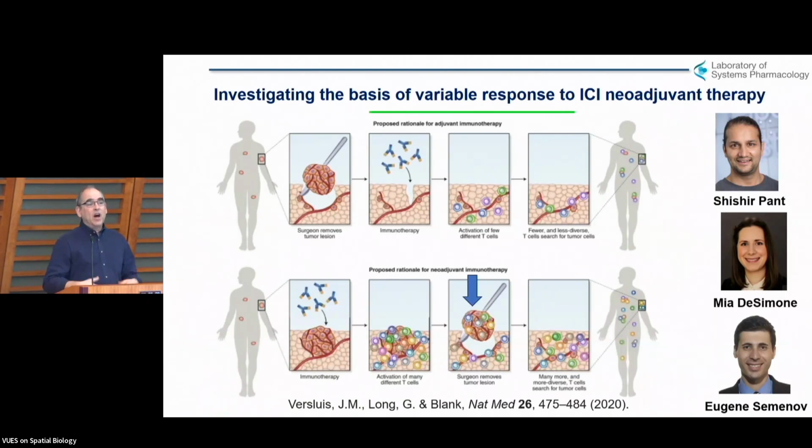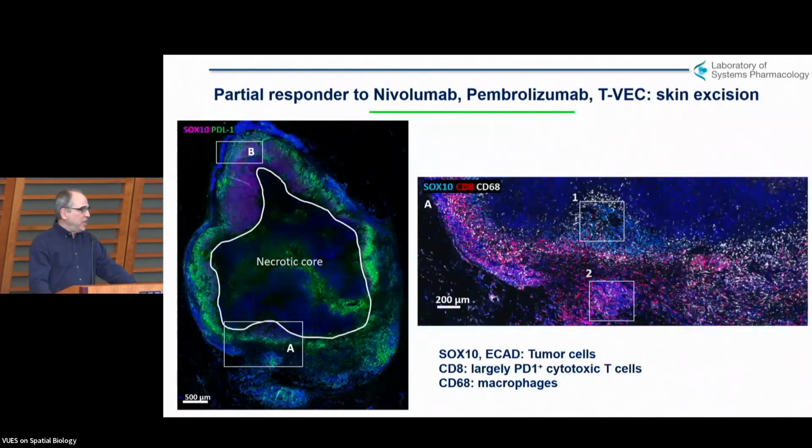from patients that have undergone a couple of cycles of therapy. So we can actually look at, and they will usually have had a diagnostic biopsy earlier, so we can get this pre-post look. And I just want to show you an example of one of these. This is in stage 3 melanoma. So it's just spread local regionally to the lymph nodes. And these patients have been treated with several cycles of immune checkpoint inhibitor. And this is what a specimen like that looks like.